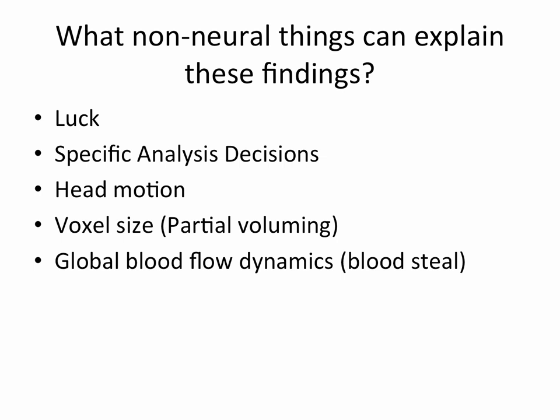Part of that is voxel size. If we're seeing things split in, maybe these are almost 4 millimeter voxels. Maybe the signal just looks so big because the voxels are so big, and this blood-steal dynamics. For time of day, I will say that most of these scans were collected at the exact same time of day per volunteer. In a third version of the study we're now doing, it just so happened that for each of the 2 volunteers, we collected at the exact same day of the week and time of day for both subjects for all 9 sessions, and these findings are still there.